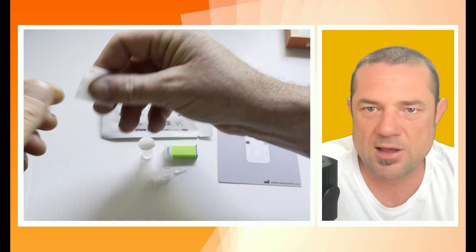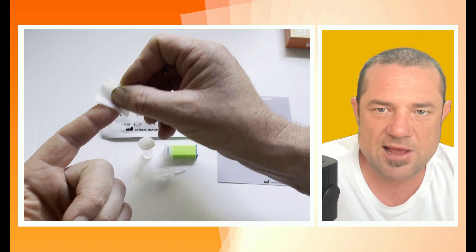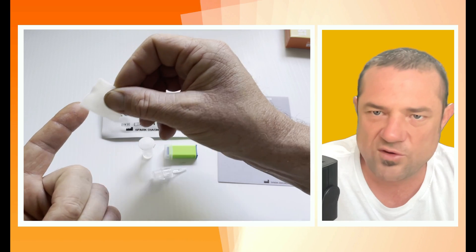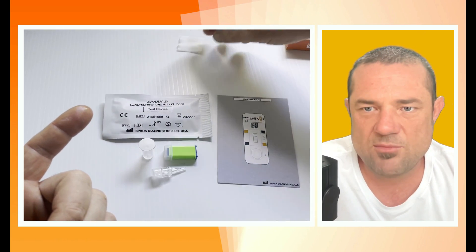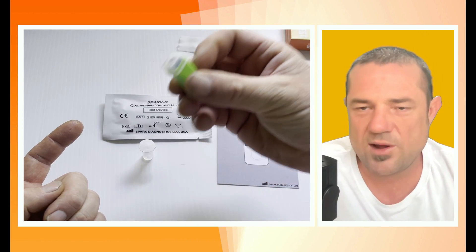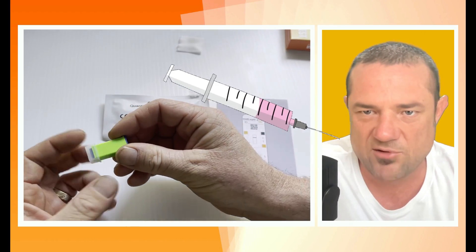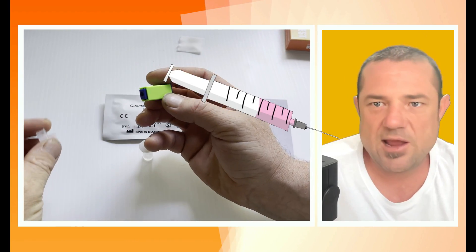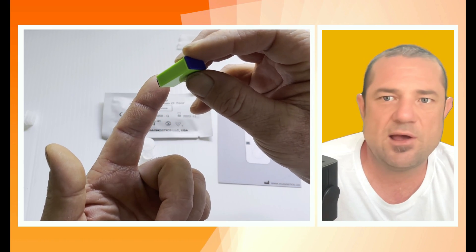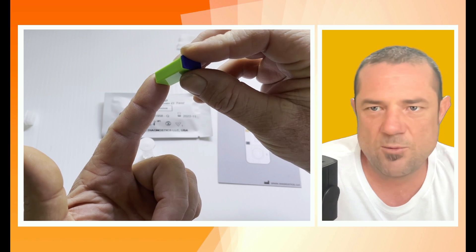The first step is to use that alcohol swab to wipe down the index finger on my left hand — my non-dominant hand — and I'll put it to the side because I'll use it again after pricking my finger. Here's the bit I don't like, but it's nowhere near as bad as having a needle put in your arm to draw blood. Single-use lancet — line it up on your finger and press down firmly, once.